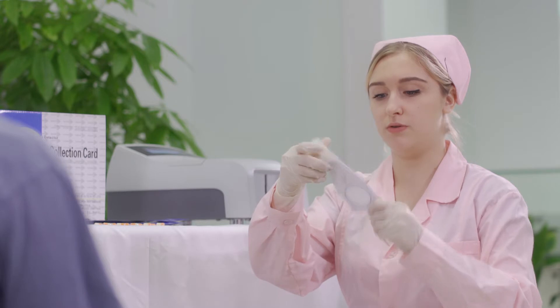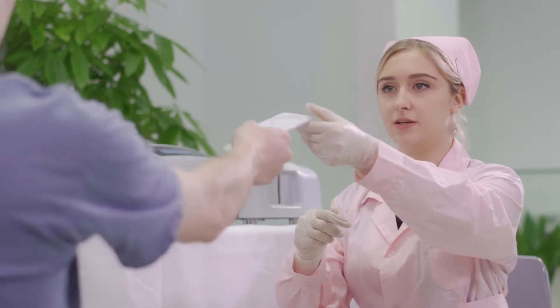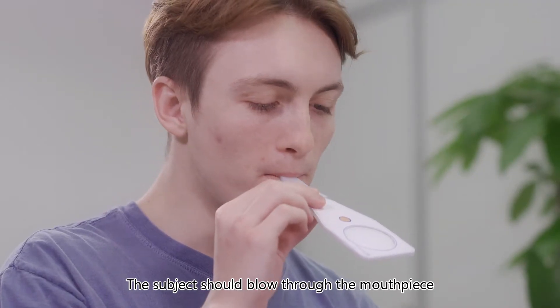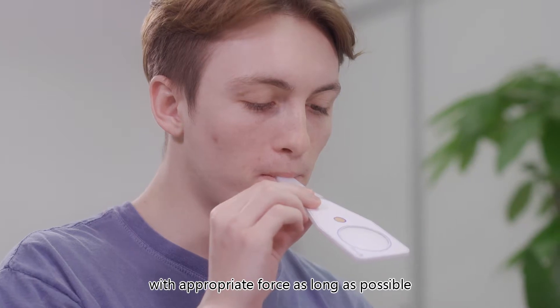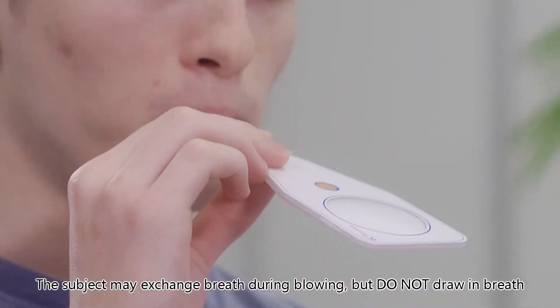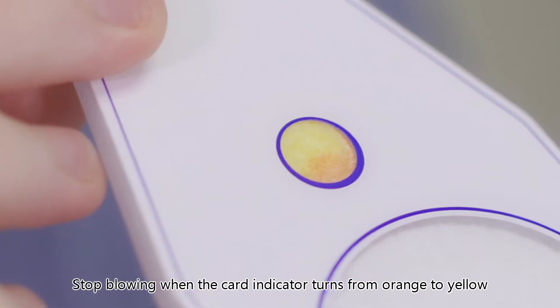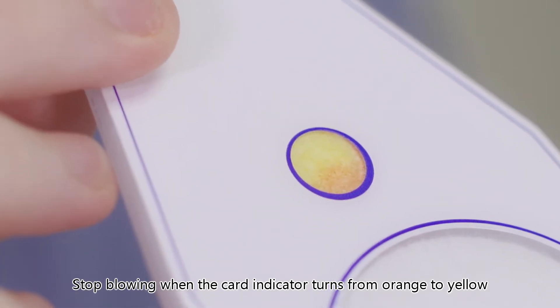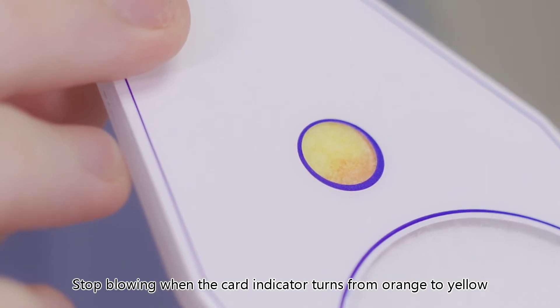The subject should blow through the mouthpiece with appropriate force as long as possible. The subject may exchange breath during blowing but do not draw in breath. Stop blowing when the card indicator turns from orange to yellow, or after three minutes even though the color is not completely changed.